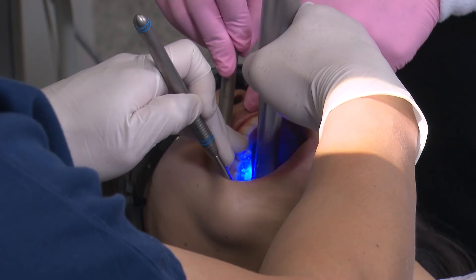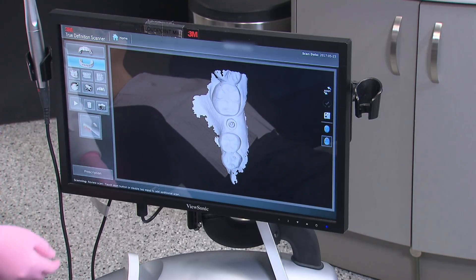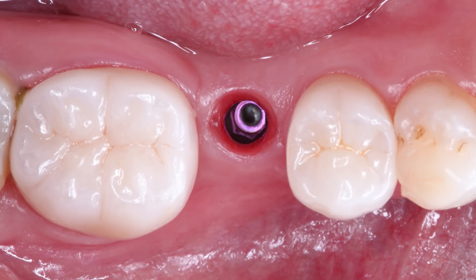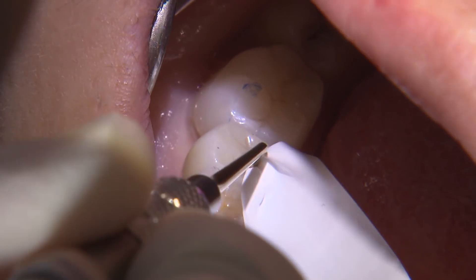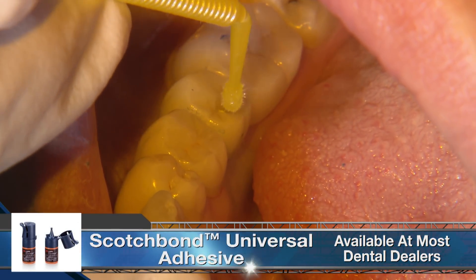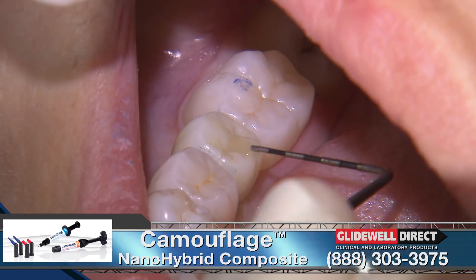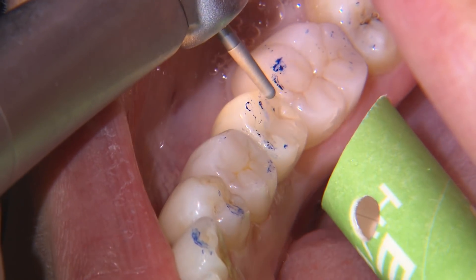Once all the scans are completed for the digital impression, we send the file in our digital prescription to the laboratory. After a week of fabrication, we receive our screw-retained Bruxer anterior crown. Once the proximal contacts are evaluated and complete seating is confirmed with a radiograph, I torque the crown down to 35 newton-centimeters. To begin the bonding process, I place 3M Scotch Bond Universal and then light cure that for 10 seconds, and restore the rest of the access hole with camouflage flowable composite. Since there's no apical mobility like with natural teeth, we want to adjust the occlusion until there is a shim stock drag and not a hold, to avoid excessive occlusal force.